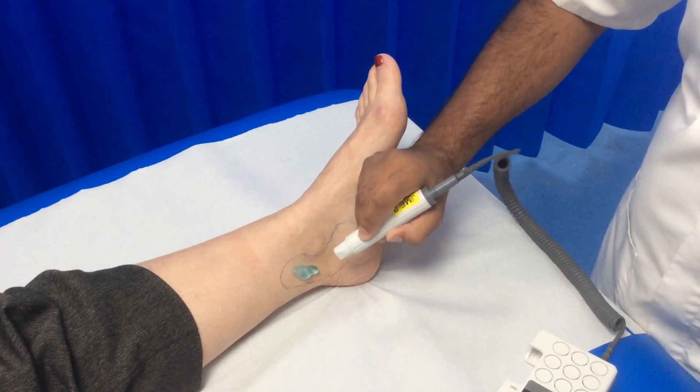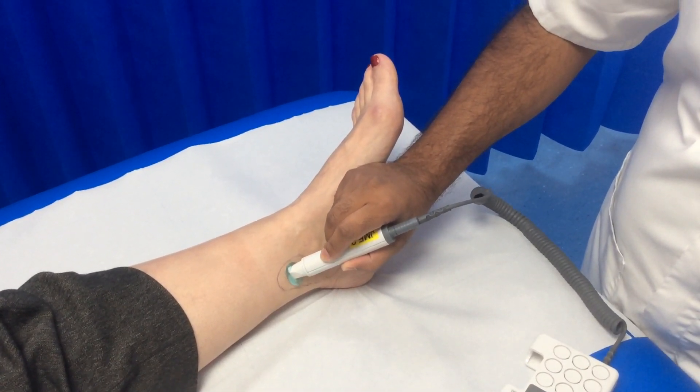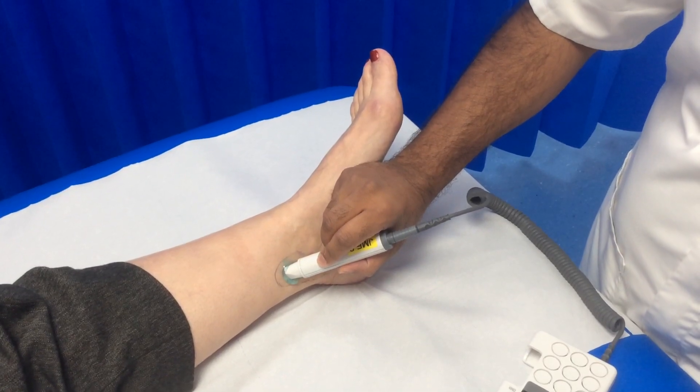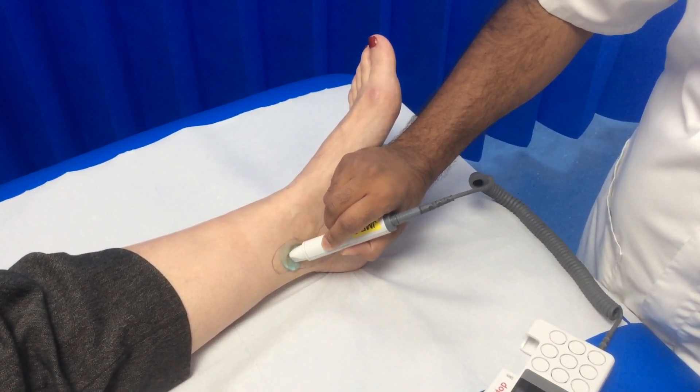Anchoring my hand against the patient's foot, I will rest the Doppler probe gently in the ultrasound gel, being careful not to press too hard on the skin. Using a slow zig-zag motion, move the Doppler probe until you find the pulse.